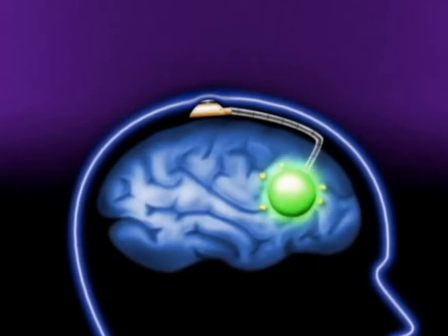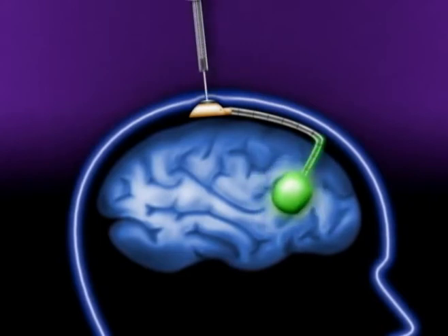Iotrex delivers radiation to the edges of the tumor cavity, targeting places where cancer may remain. The Iotrex and saline mixture stays in the balloon catheter for approximately 3 to 7 days until the prescribed dose of radiation is delivered.